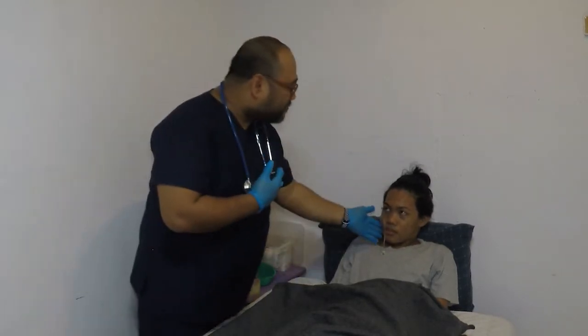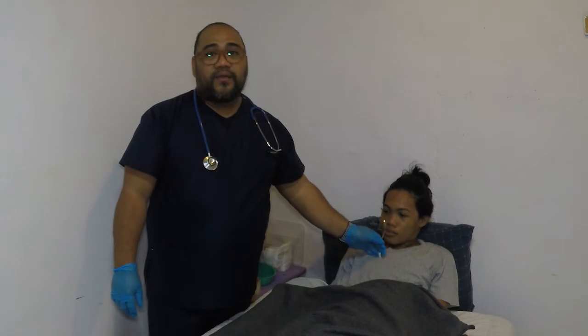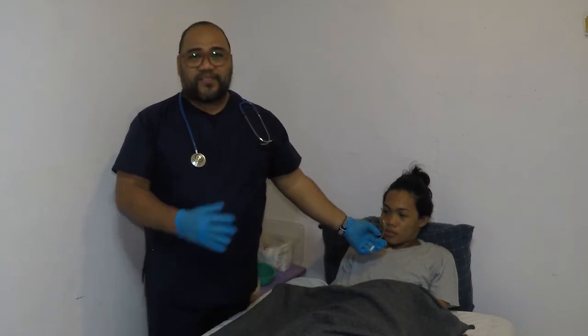The tube is not in the esophagus if the client shows signs of distress and is unable to speak or hum. Okay, so can you hum? While keeping one hand on the tube, verify the tube's placement in the stomach.